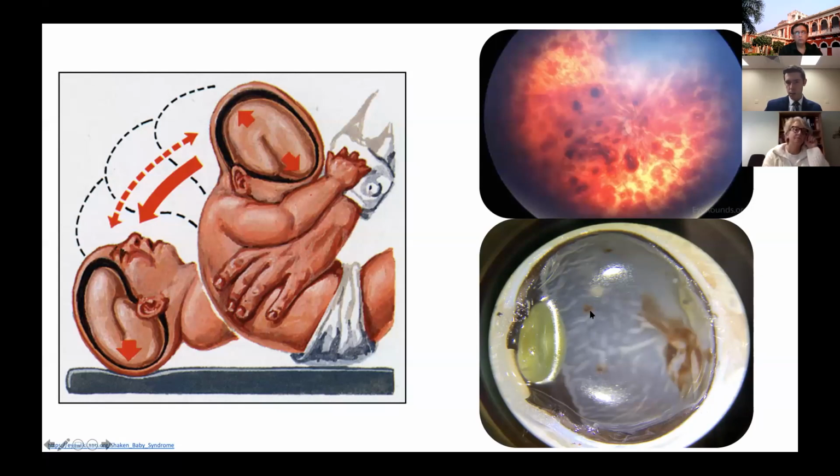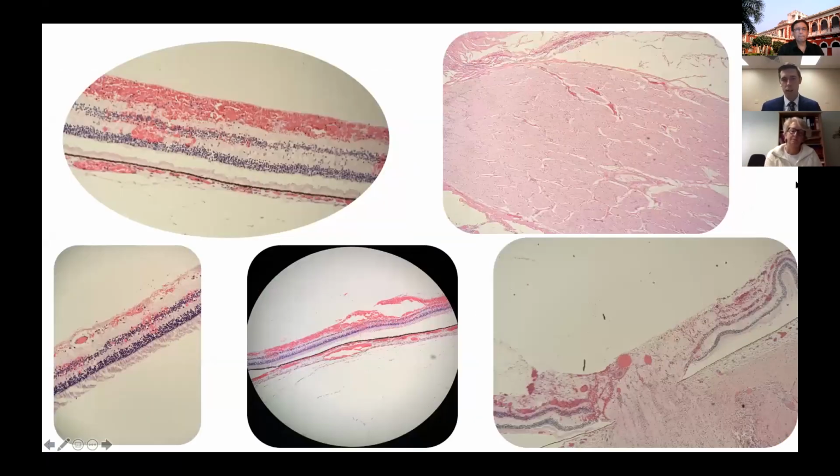And you can see hemorrhages diffusely here, some dot hemes, and then some emanating actually from the nerve itself. And this is the gross specimen here with the retina folded up on itself as well. And then these are photos also from Dr. Potter's pathology lab with NAT cases that we have in the teaching file set, as well as one from that poor baby that we just saw, but hemorrhages represented in all layers of the retina.